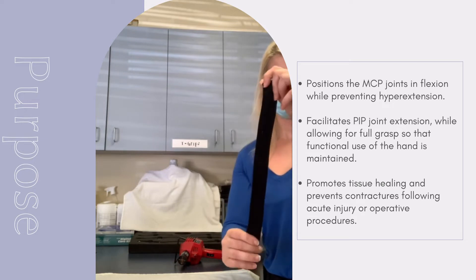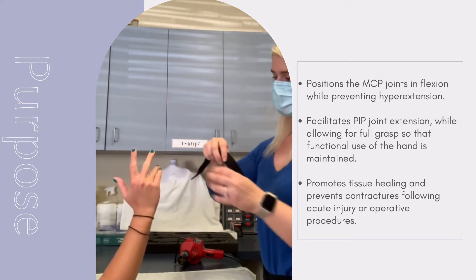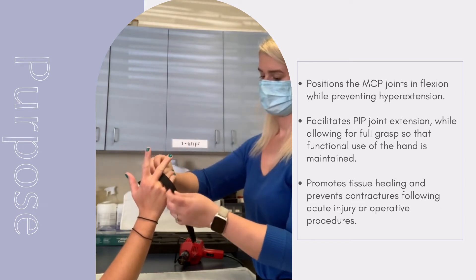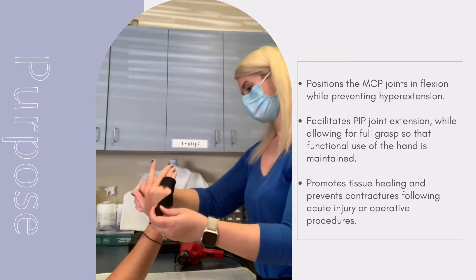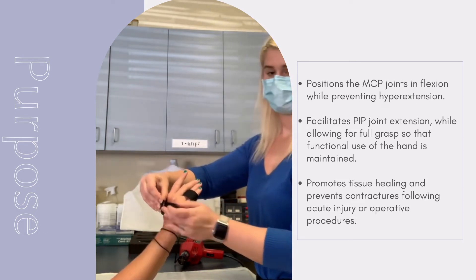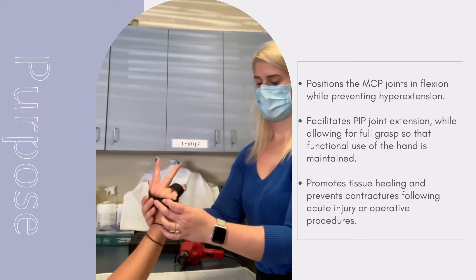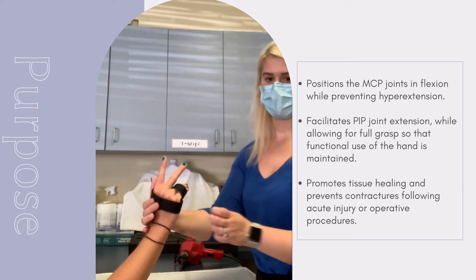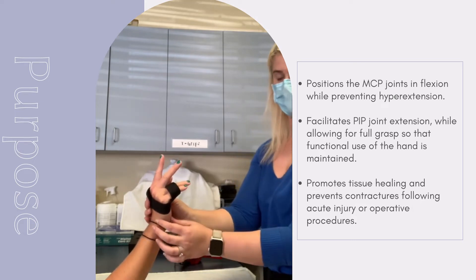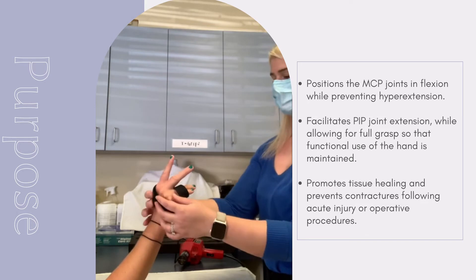Next, the orthosis is fitted to the patient by starting on the dorsal aspect of the ring and small finger. The material should be draped over the fingers at about its halfway point. The parts of the material are crossed at the base of the finger near the distal palm crease, and brought back around to the dorsal side of the hand. The material should pass through the web space where the thumb and the index finger meet, and anchor on the dorsum of the hand.